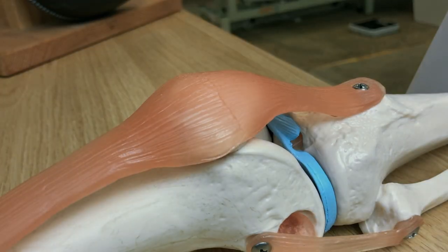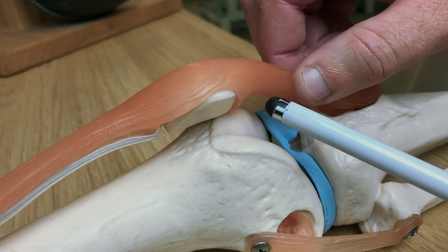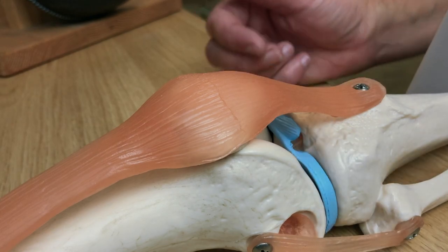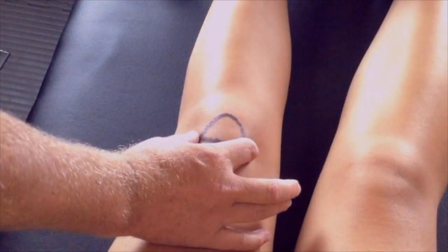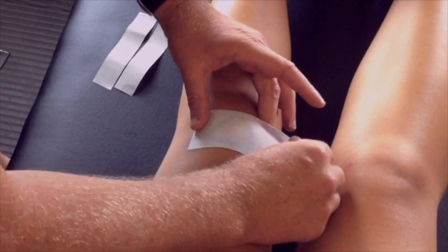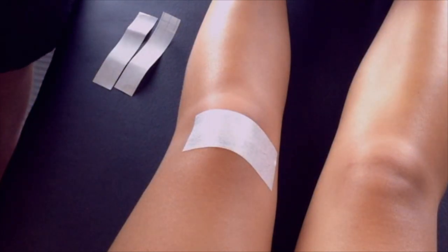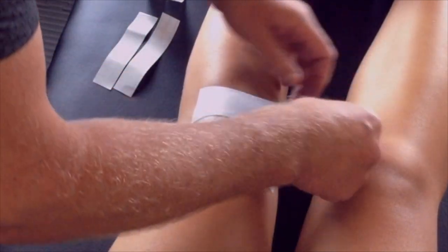Our aim in patellofemoral joint taping is to maximise the space between the patella and the lateral edge of the femoral groove. Here we look at the lateral articular facet of the patella, which is where usually we see the irritation occur. To make it easier for you to follow along, we've marked out the approximate location of the patella. To improve the longevity of your taping job, use some fixamol underneath your taping to get maximal adherence to the skin. The fixamol should run from outside the kneecap right across to the medial aspect of the knee.